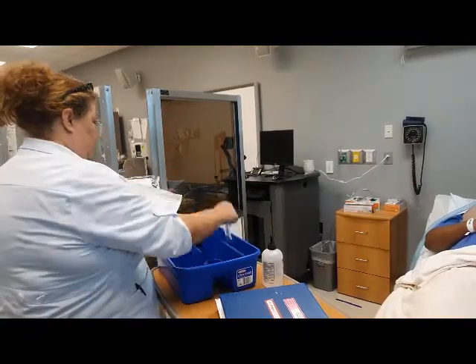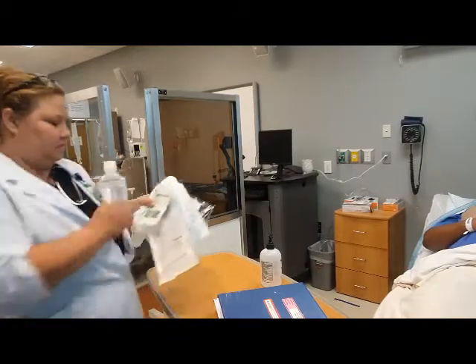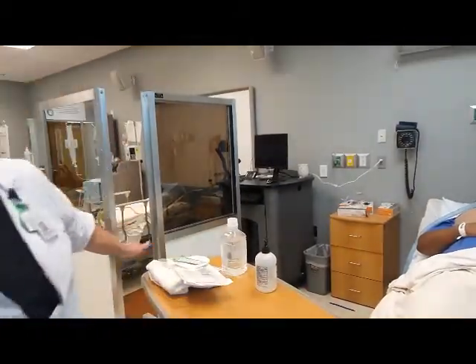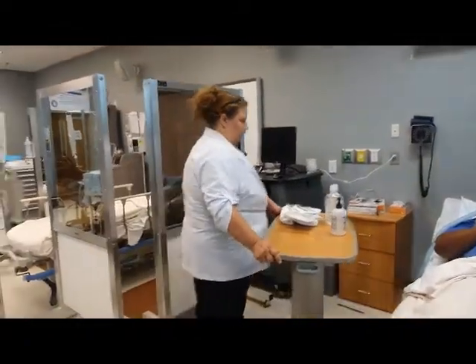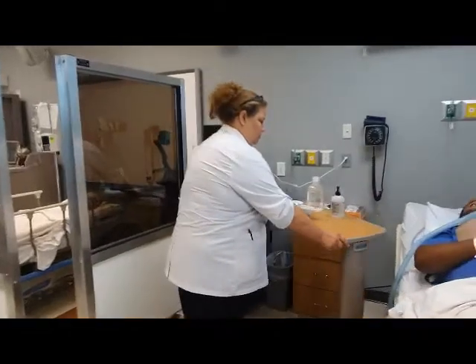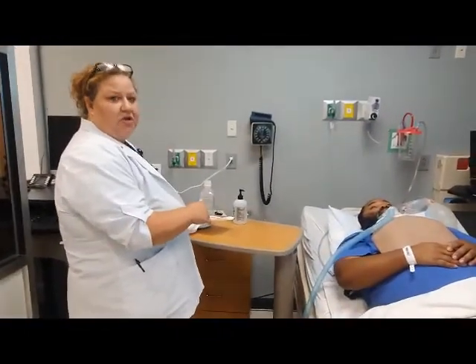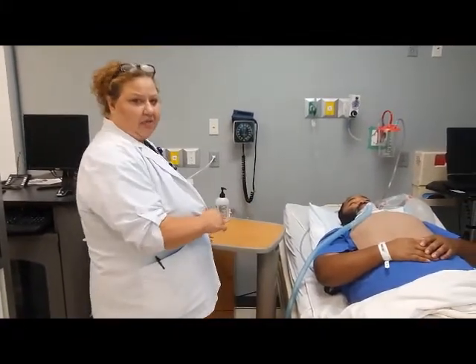Now you'll go into the room, explain your procedure to your client, provide their privacy, and position them in Fowler's. What I'm doing is getting the table set up so I can actually reach and not be contaminating as I go back across.